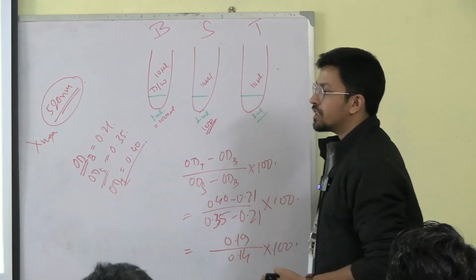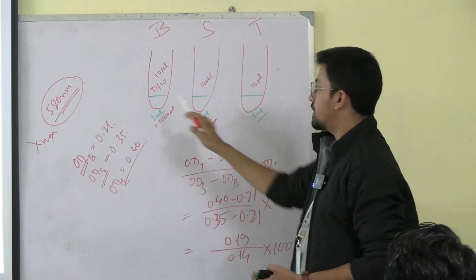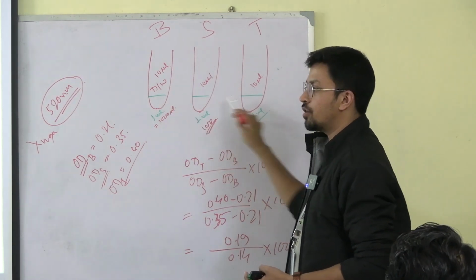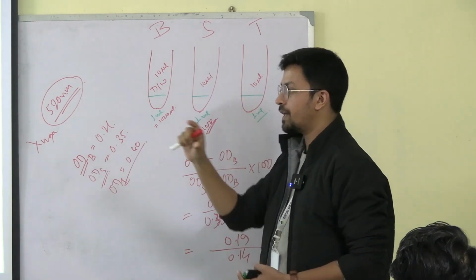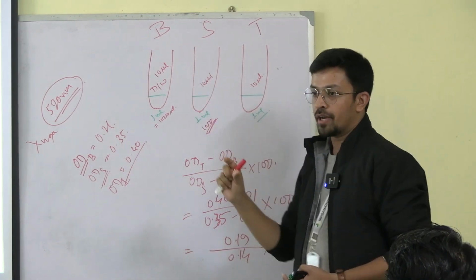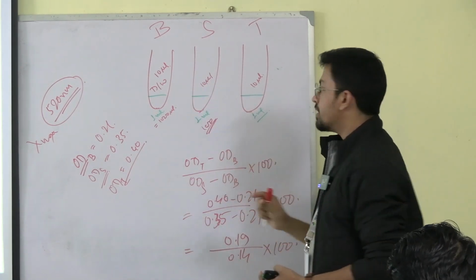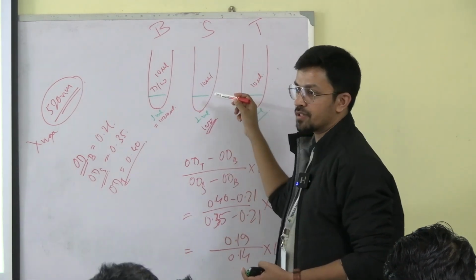Whenever you are using the micropipette, first of all you take the 3 GOD POD samples in all the 3 test tubes. Use a separate pipette tip, because that pipette tip will be a little larger. For the 10 microliter you will be using the narrow microtips. Let's say somebody is taking the standard sample first.